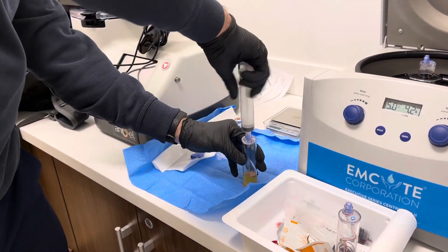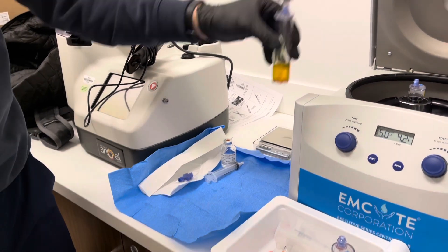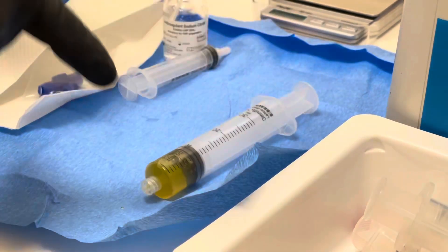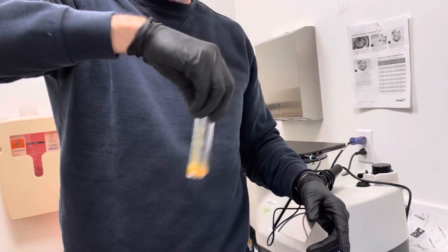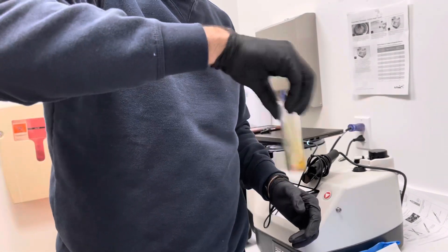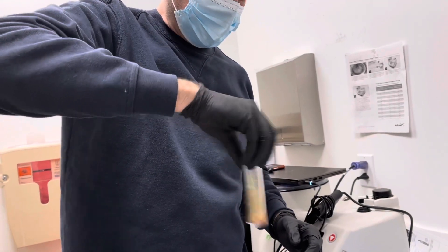Coming out of the centrifuge, give it a good clean. Drain off the plasma that we do not want — you can see they're marked on here, and that big mark is five — so I'll keep it fairly flat so I know I'm reasonably accurate. Pull that down to five ml. I usually go just a little bit lower because you can always add some back. Then you've just got to resuspend the platelets back into the sample. Reliably this is in the early 90 percent of all of the platelets available out of the sample — not 100 percent efficient, but compared to everything else it's about 60 percent, so it's a huge step up for the same amount of blood.